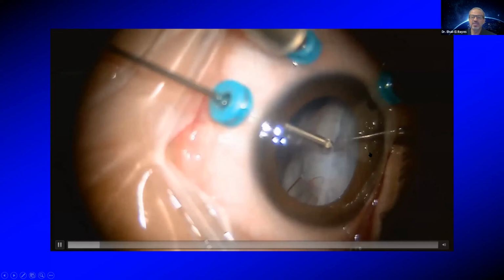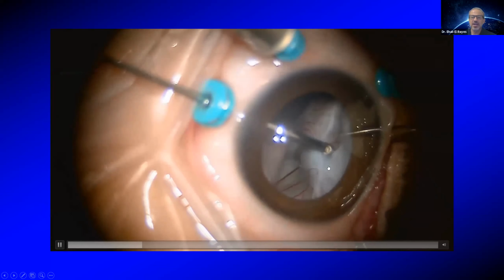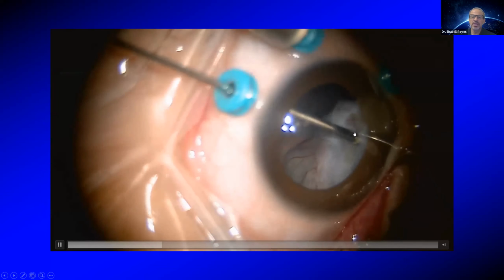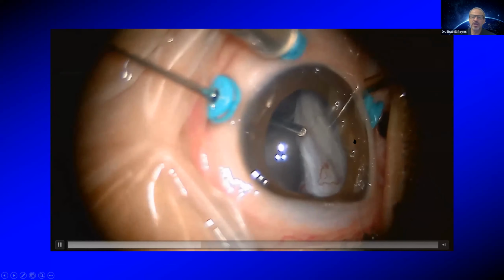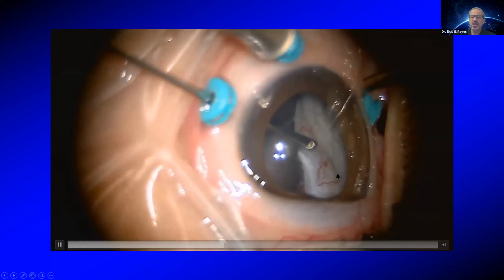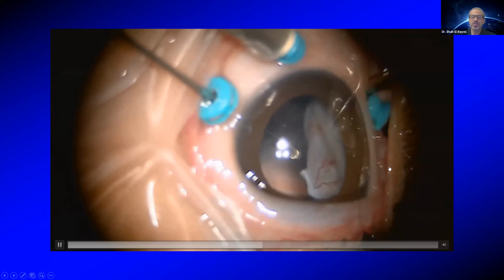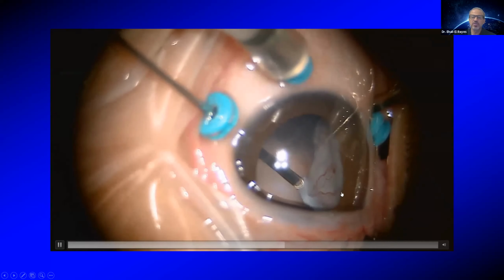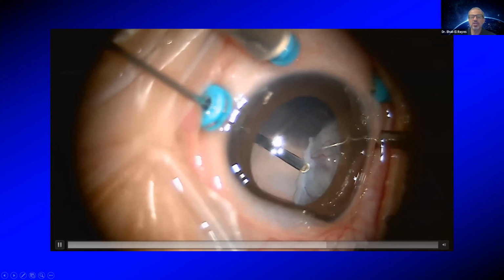When you indent, this avoids having bimanual surgery because you can support the retina inside the eye. And I can use the cutter to delaminate or open planes or remove tissues off the retina here while indenting from the outside by direct visualization. And you can see the thick membranes are easily delaminated and shaved off the retinal surface by indenting from the outside the eye supporting, and even using it as a scissor to cut right through tissues here.